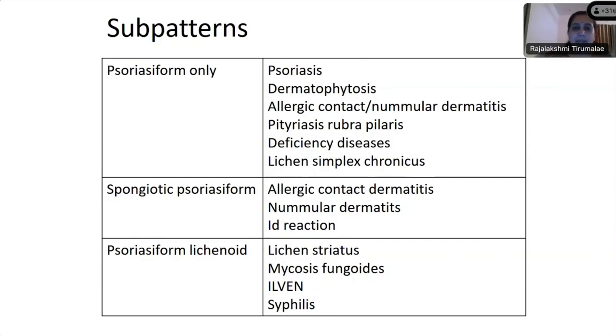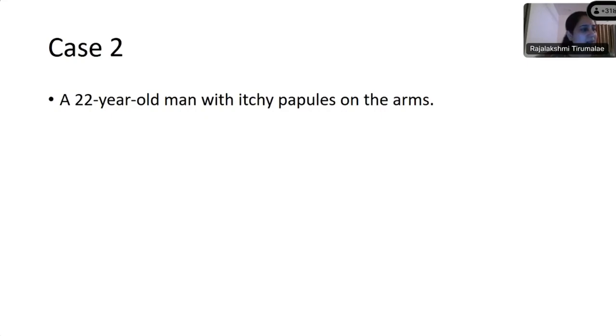Just to expand on that, I think Ishita, the rete ridges are described as test tube shaped. It is easier for us to remember. The bottom is a little bit rounded and broad. Rounded, yes. Broad based. Thank you. And thank you, Dr. Ishita, for a very well described slide. So we'll move on to the next case.